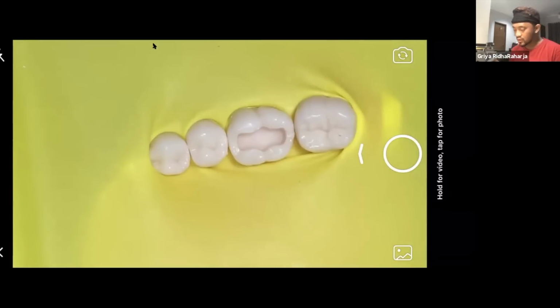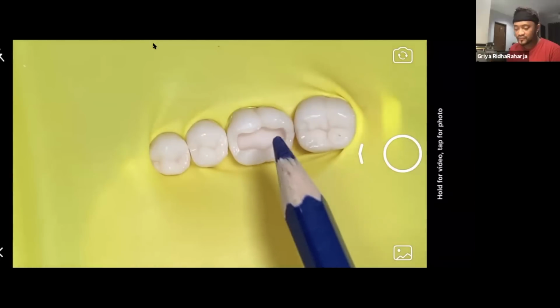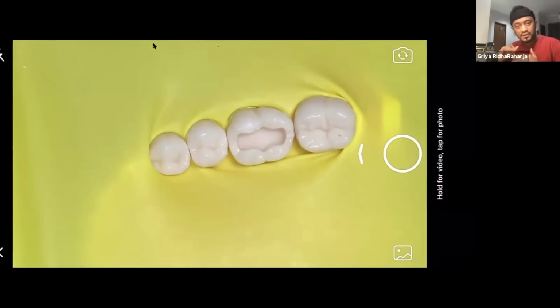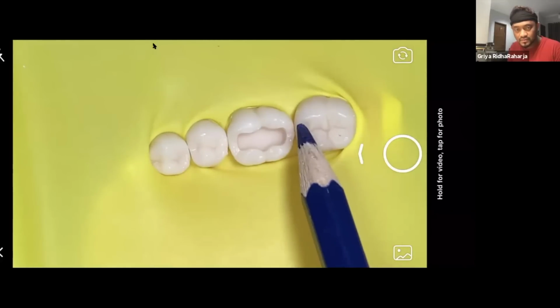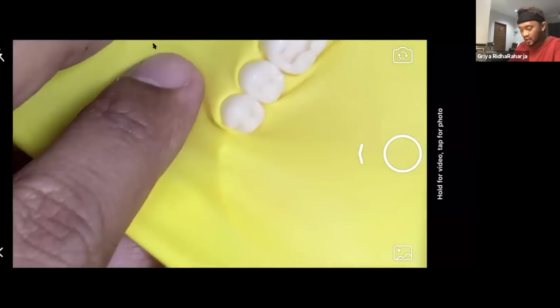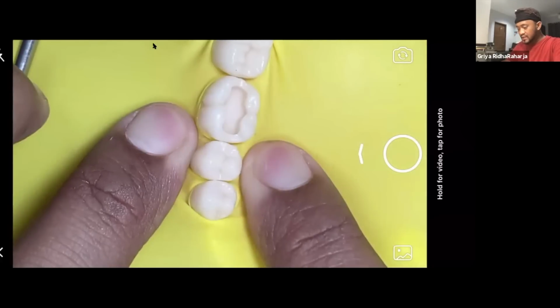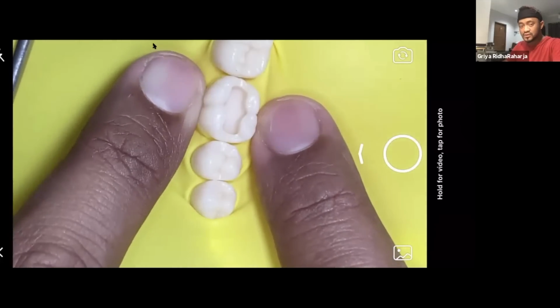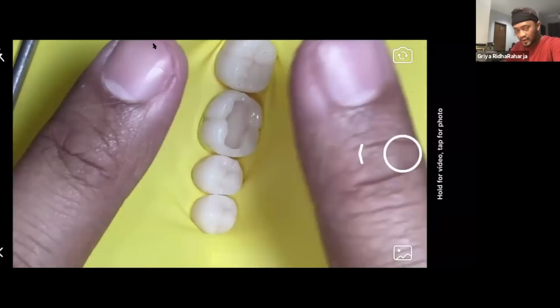So if you push on the hole at the tooth, it is going to be wrong because sometimes if you put it inside, it comes out, inside and out, inside and out. There's no retention there. So all you have to do is put it inside in here, interproximal, interproximal, interproximal. That's the key of the retention of the rubber dam. Got it? But in a real patient, please start from the premolar, first premolar, second molar. Sometimes if you want to do the molar, it's a little bit difficult. Your patients need to open so big, open the mouth, and then push again.